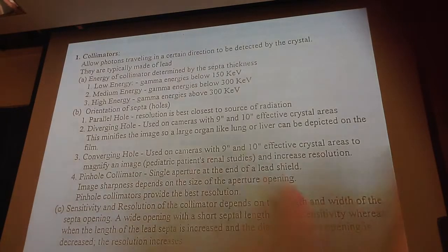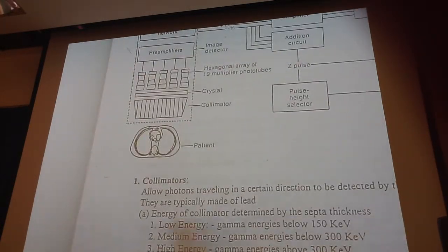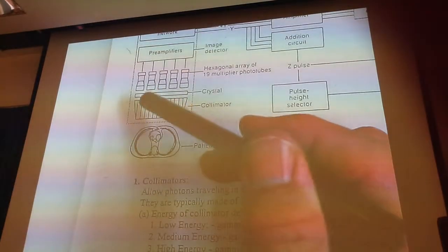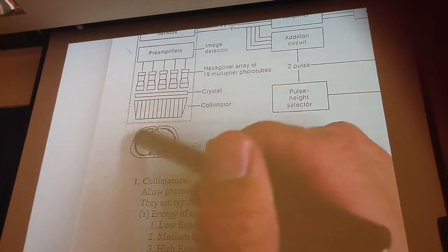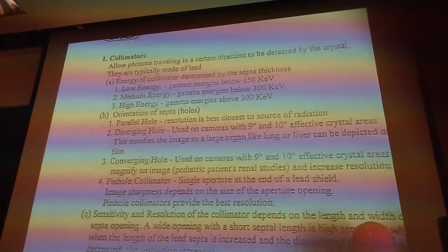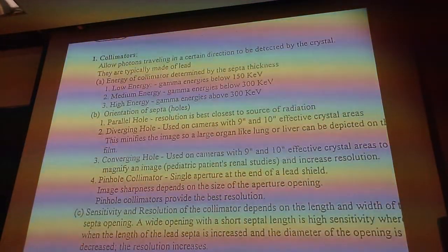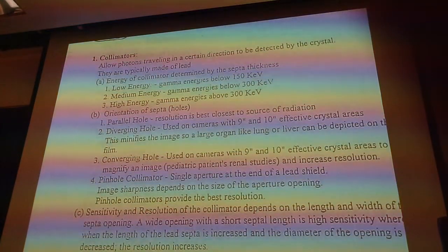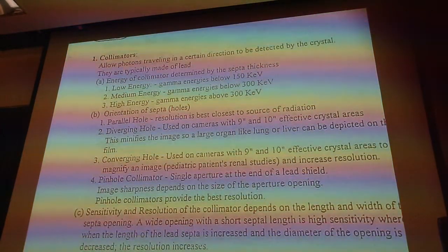Okay, on this one here, guys, I'm going to change this a little bit because they kind of changed the definitions here. But you notice on this collimator here, this is what we call a parallel hole, in that the openings on the septa are straight. And so basically the definition of a collimator, a lot of you are going to be tempted to say it controls the energy of the radiation interacting with the crystal.